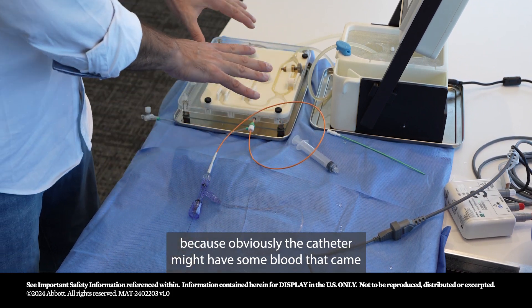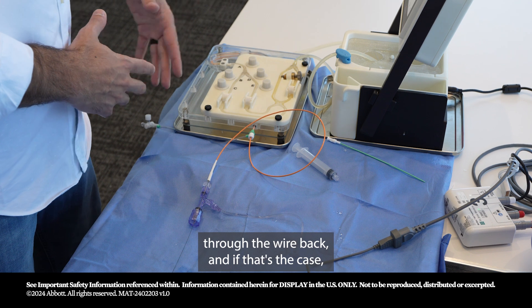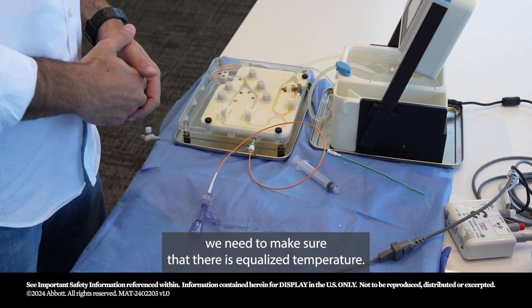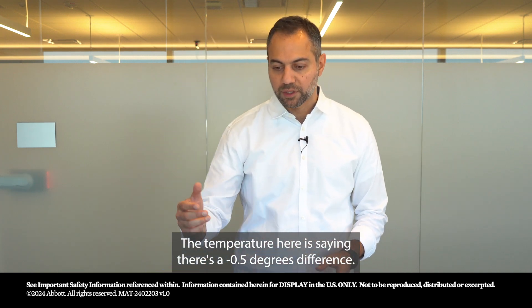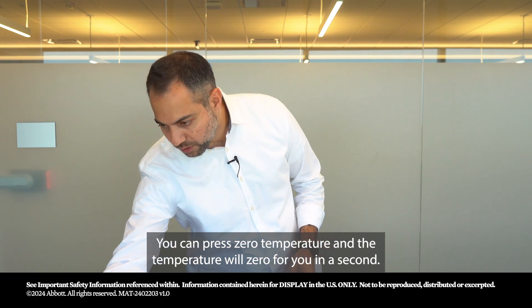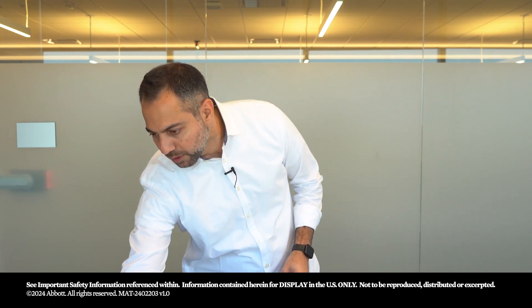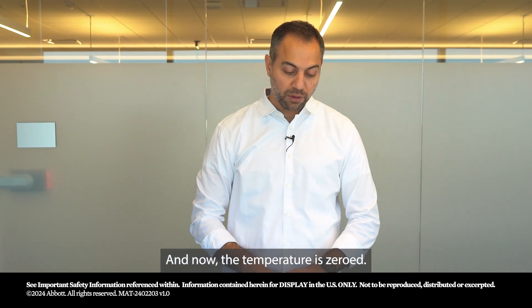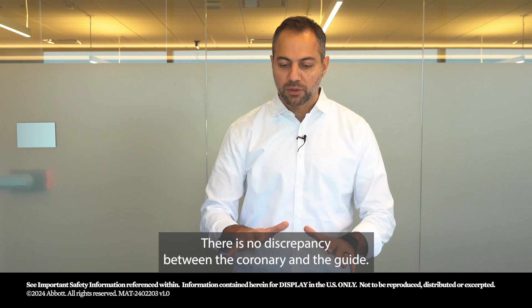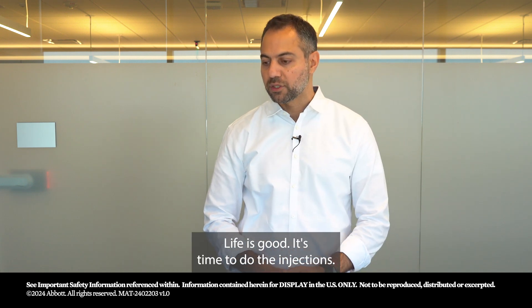This is a good time to do hygiene, because the catheter may have some blood that came back through the wire. We need to make sure there is equalized temperature. The temperature is showing a negative 0.5 degree difference — press zero temperature and it will zero in a second. Now the temperature is zeroed. After flushing the contrast, I'm ready to go. There is no discrepancy between the coronary and the guide.